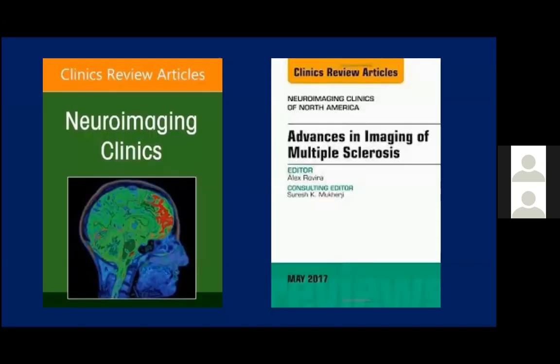So I basically used Neuroimaging Clinics of North America articles, especially the issue that came out in 2017, for the images and some relevant information. I will talk in the beginning about the basics of MS, what we know about MS, and then I'll talk about the MR imaging of MS in detail, and then I'll also talk about some other diseases which can look like MS on imaging, and then the future of MR imaging in MS.